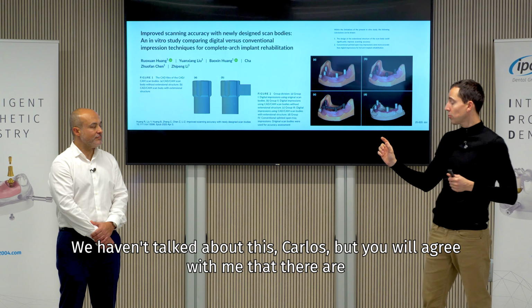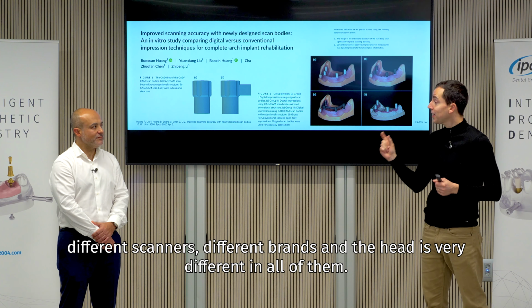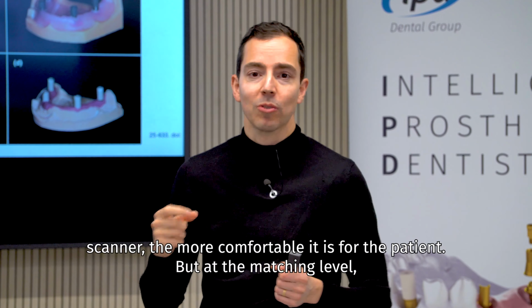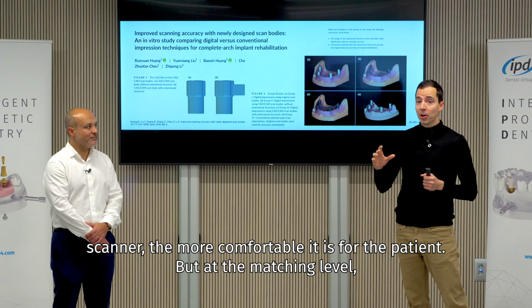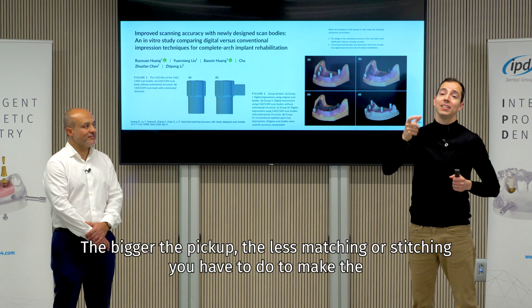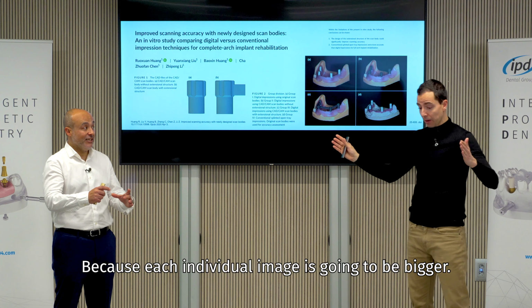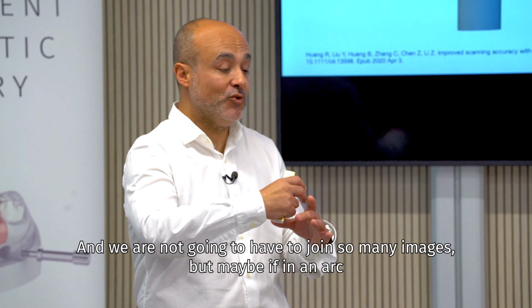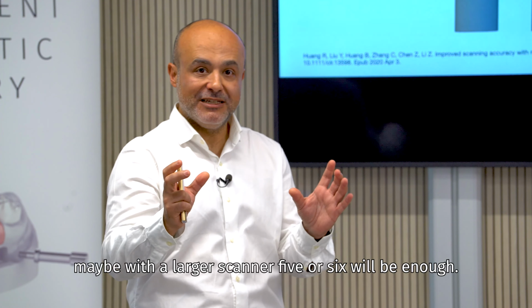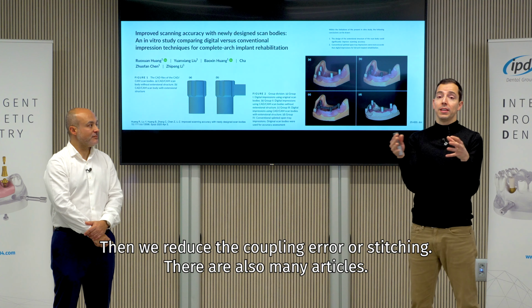We haven't talked about this, Carlos, but you will agree with me that there are different scanners, different brands, and the head is very different in all of them. So there is a contradiction, and it is that in the mouth, the smaller the scanner, the more comfortable it is for the patient, but at the matching level, which you have explained very well, the bigger the pickup, the less matching or stitching you have to do to make the image of the complete arch. Because each individual image is going to be bigger, and we are not going to have to join so many images. Maybe in an arch we had to have 8 overlaps, but with a larger scanner, 5 or 6 will be enough. Then we reduce the coupling error or stitching.